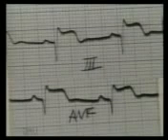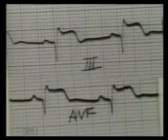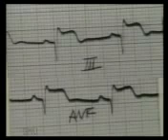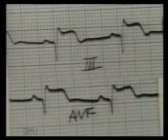This is another inferior wall infarct with ST elevation in leads 2, 3, and AVF and ST depression in leads 1 and AVL. The T waves are just inverting, so the infarct is 2 to 3 days old. In close-up view, note the deep Q wave and ST elevation in leads 3 and AVF, and the reciprocal ST depression in AVL and V3.